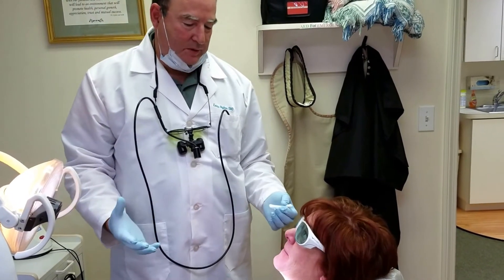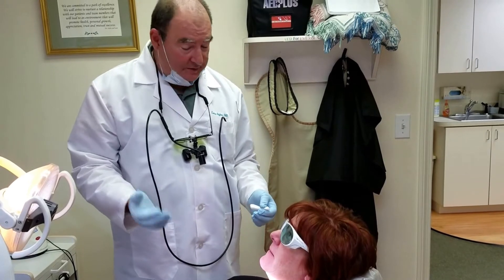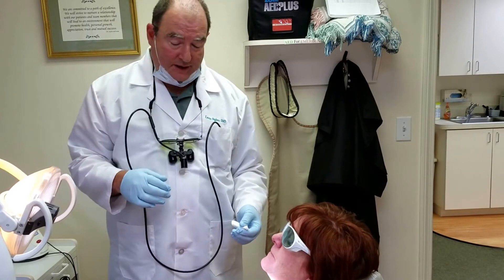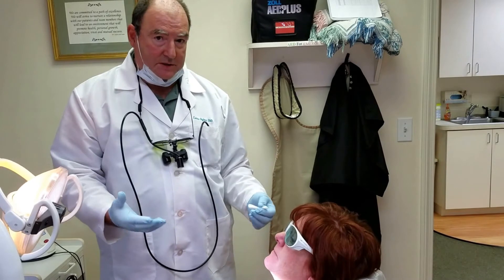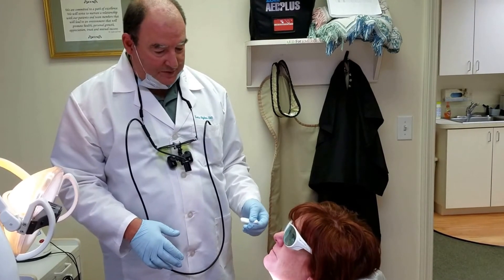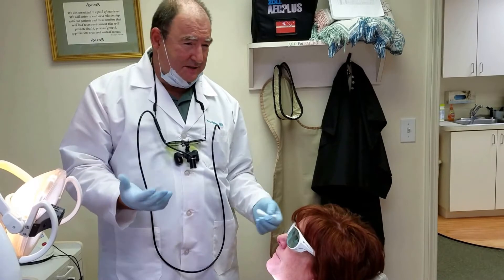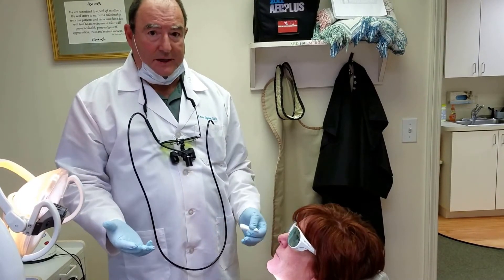This is a nice, easy treatment that will help give the patient immediate relief using a very specialized wavelength with a laser. With just a few seconds, it will create a much, much more comfortable situation. So instead of using all those creams and ointments that kind of just make things a little bit better for a short time, this is like an immediate solution.